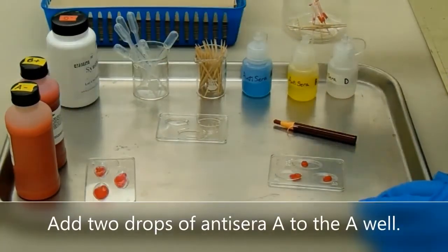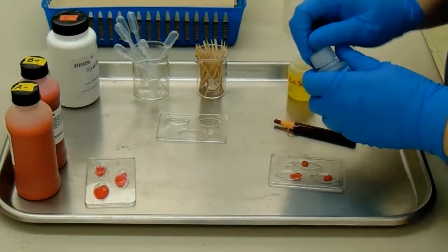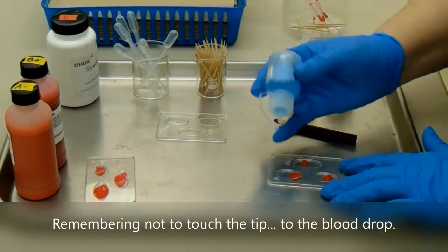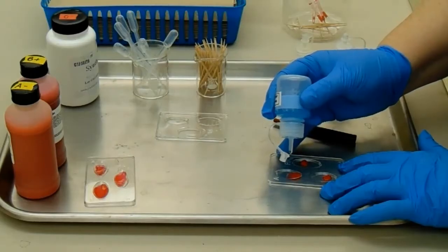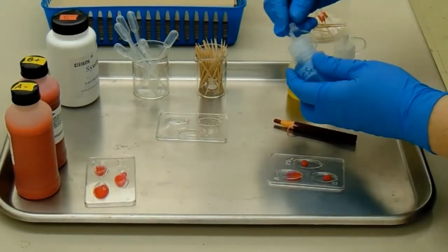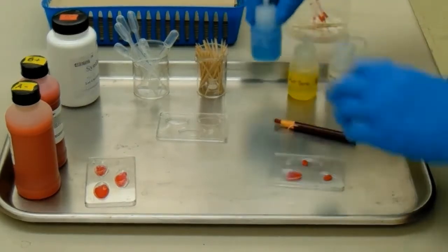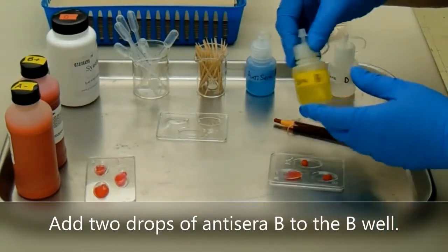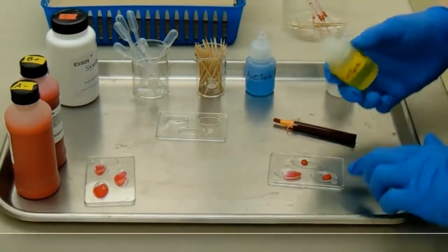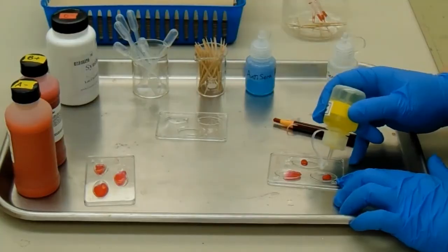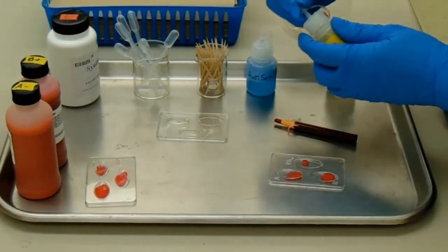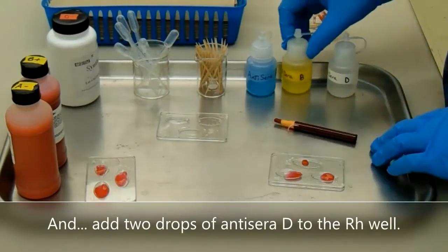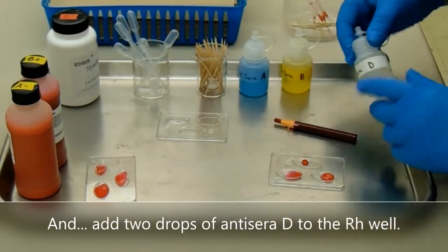Add two drops of antisera A to the A well, remembering not to touch the tip to the blood drop. Add two drops of antisera B to the B well, and add two drops of antisera D to the RH well.